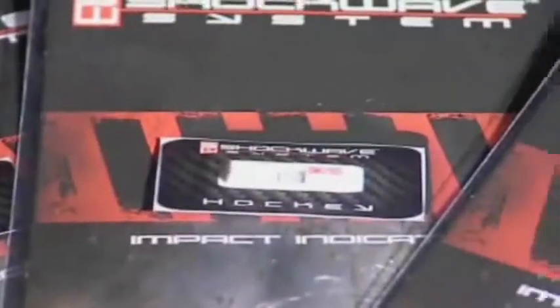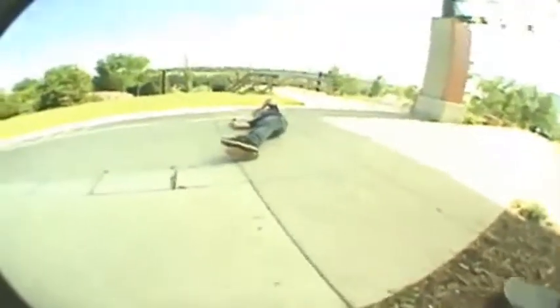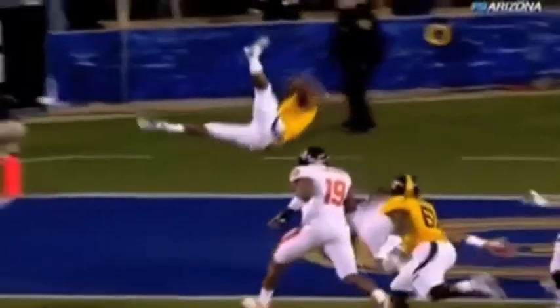The device isn't going to tell you have a concussion, but it's going to tell you where you've been previously when you're okay. And all of a sudden, if you can't balance or can't do certain things, this electronic device is going to tell you otherwise: for the last 4 events before you went out there, you fell between these 2 parameters, and all of a sudden you're outside those parameters. What has changed? Did you hurt yourself? Did you fall and hit your head? Or did you sprain an ankle? Why is it that you can't balance correctly?